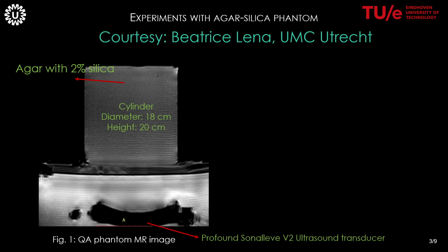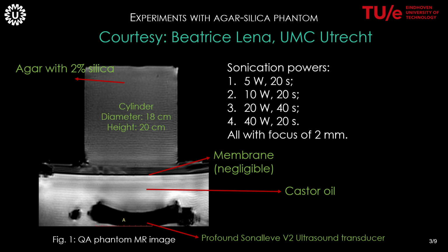Underneath is the Profound V2 ultrasound transducer, which is embedded in castor oil. And between the oil and the agar sits the mylar membrane, which is very thin and has a negligible effect on the acoustics. 4 sonications were performed on this phantom at different power levels, some with different timings during sonication.